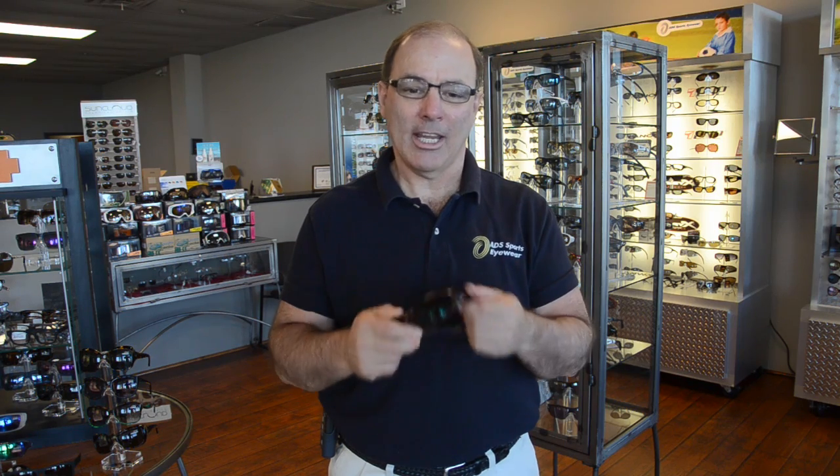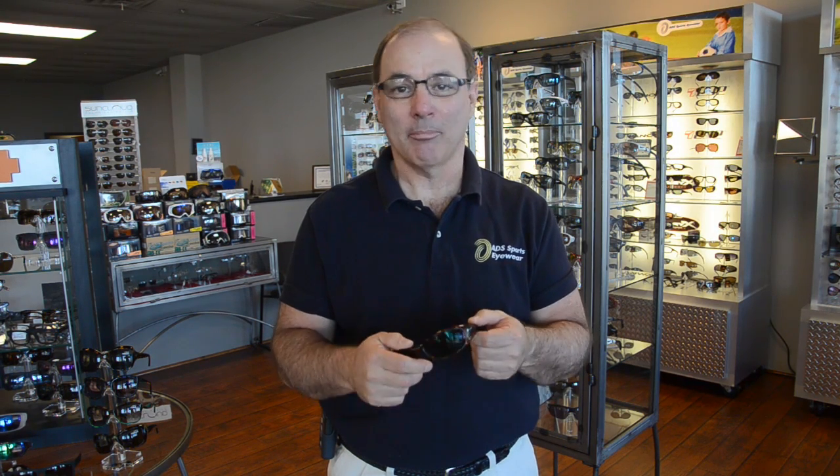I'm Dave with ADS Sports Eyewear. In this video we're going to show you how to remove and reinstall a prescription lens in a full-frame pair of sunglasses.